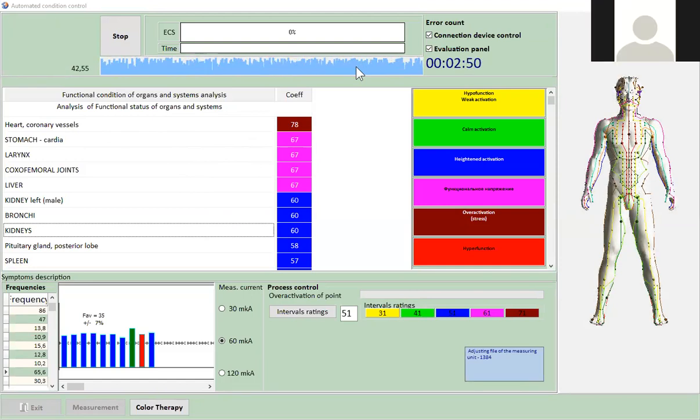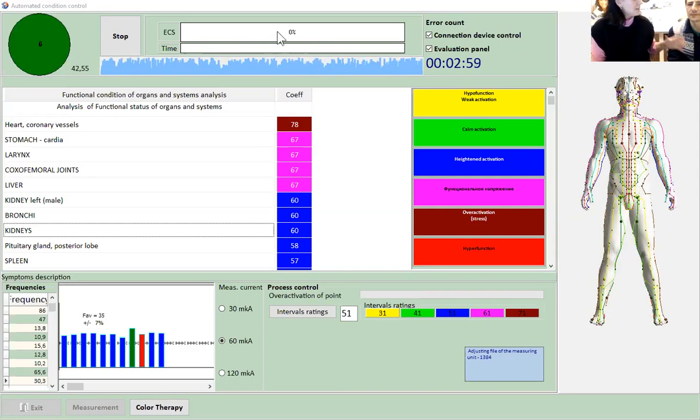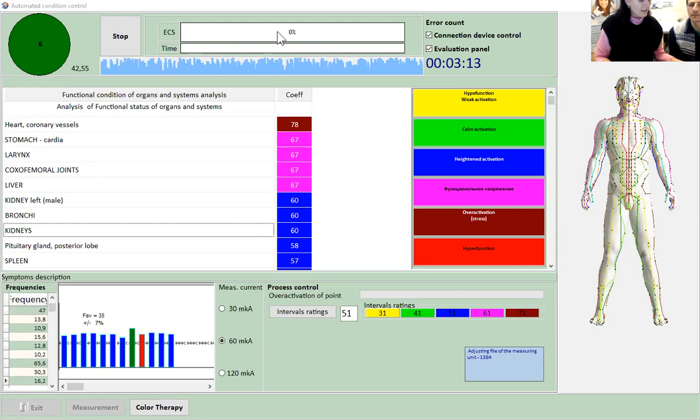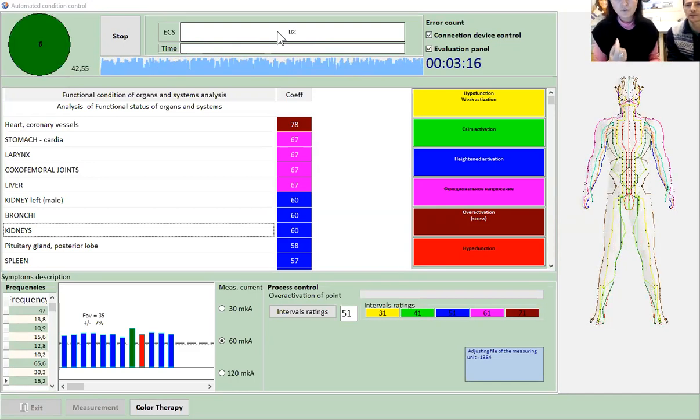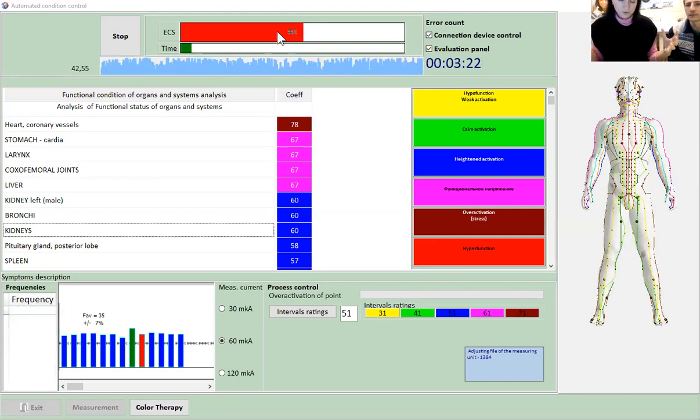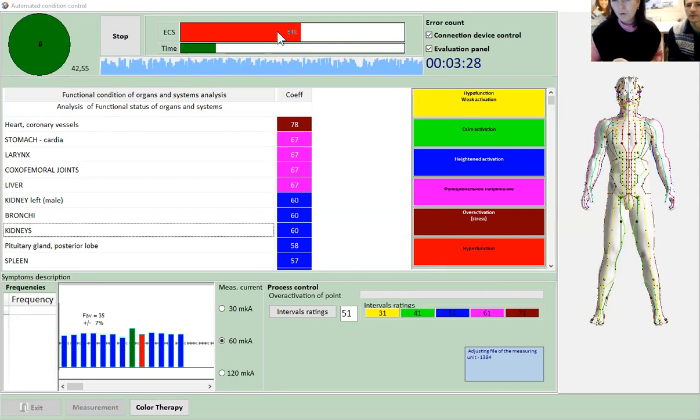Up on the top line, the ECS, previously when you were measuring, it was around the 20s, 26 or something. This is how he accepts and shares energy, producing the energy flow in his body. So is that where you would see 20 to 70 as normal? It was 50, but that's why the program chooses the best point, so we can put more energy in this point. We don't do the same points as before. Now we choose the best points in his body.